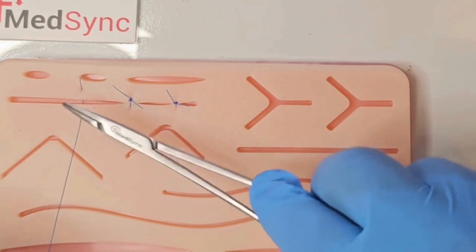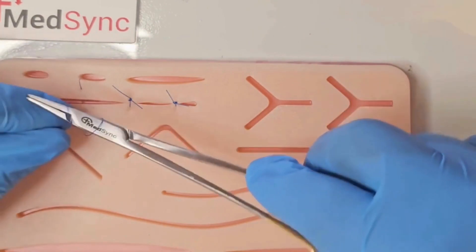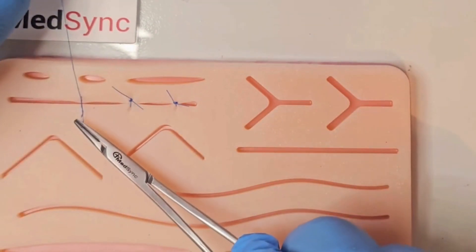You perform two revolutions around the needle holder. This is a surgeon's knot. Pull the suture through.